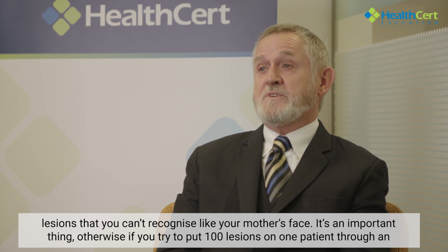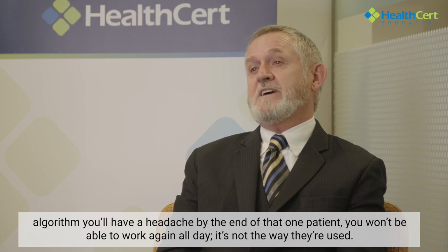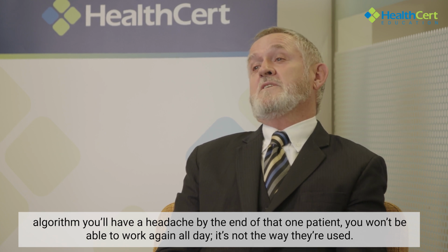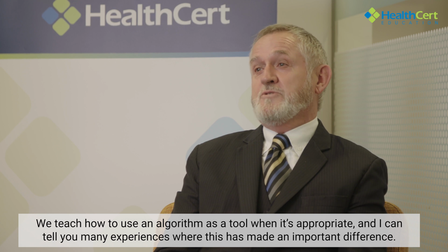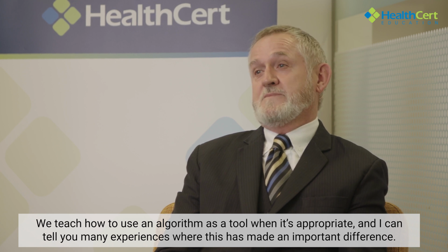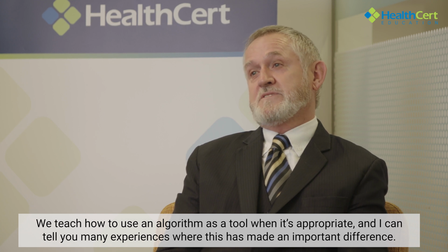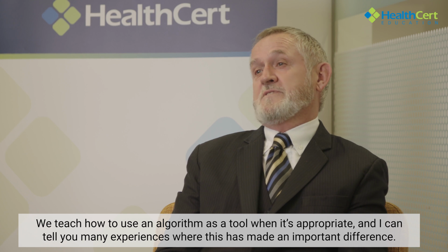Otherwise, if you try to put 100 lesions on one patient through an algorithm, you'll have a headache by the end of that one patient. You won't be able to work again all day. It's not the way they're used. So we teach how to use an algorithm as a tool when it's appropriate, okay? And I can tell you many experiences where this has made an important difference.